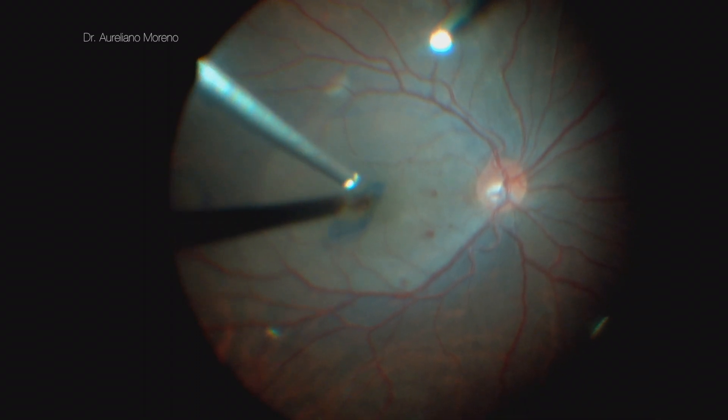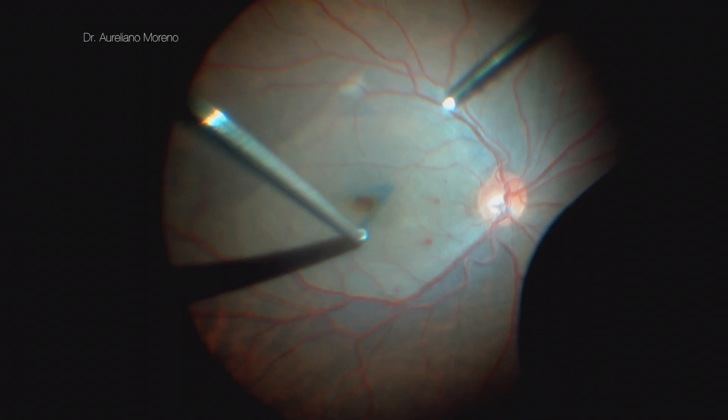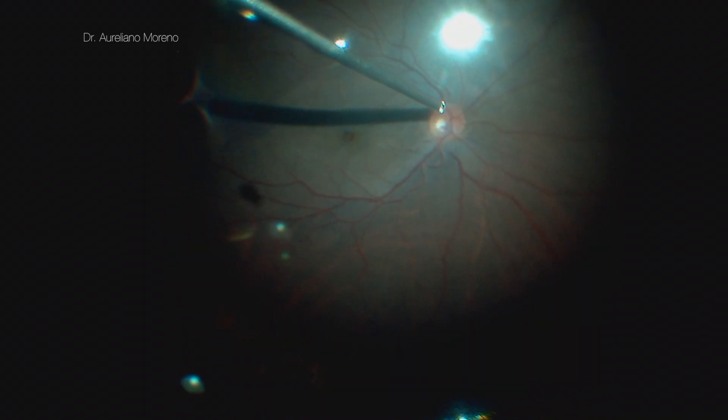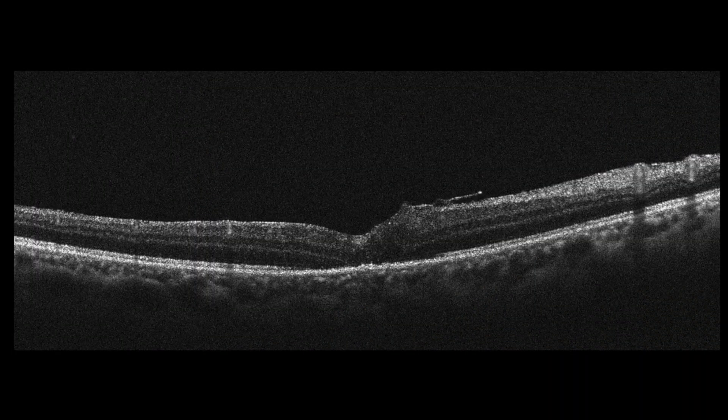I trimmed the flap to the size of the macular hole. Two weeks after surgery, we can see the macular hole closure.